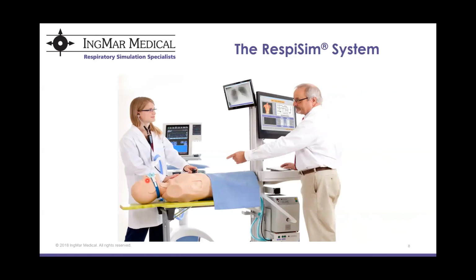So the mask would go on the mannequin's face here, and our mannequin's face is built to work well with non-invasive masks. He actually has a very good face for that.